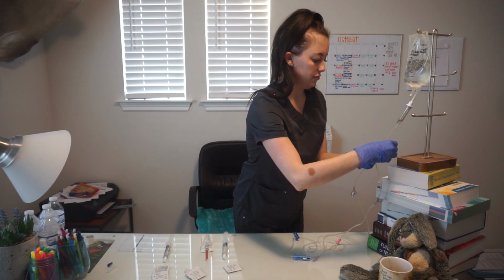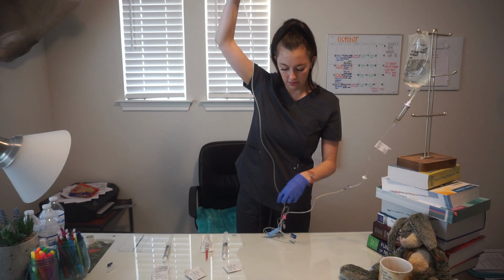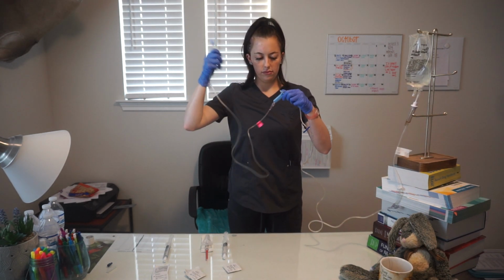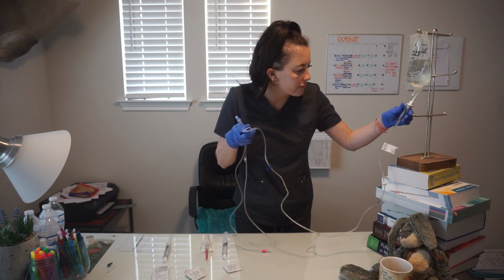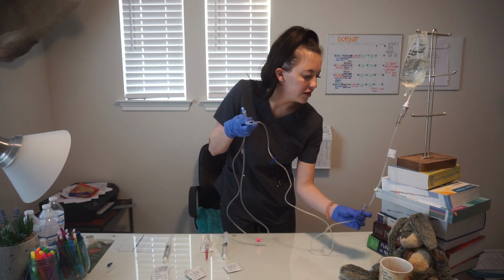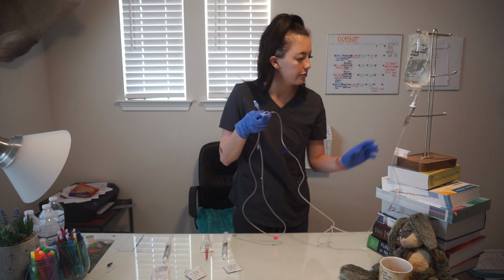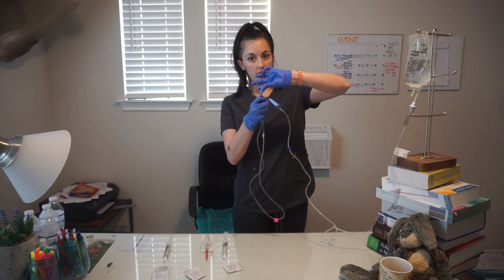Labeling. Alrighty, I'm also going to flush the line for any air bubbles in here. First I'm going to squeeze the drip chamber, get that about halfway full. I'm going to try to keep this facing up, this first Y port. It doesn't really want to stay up. It's about halfway full, so now I'm going to take this off aseptically.